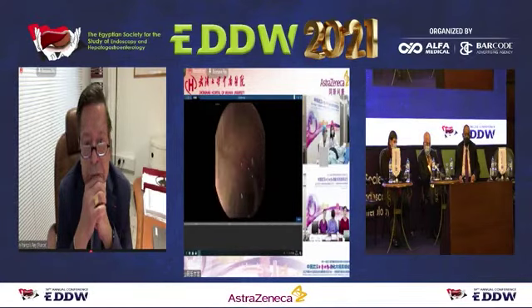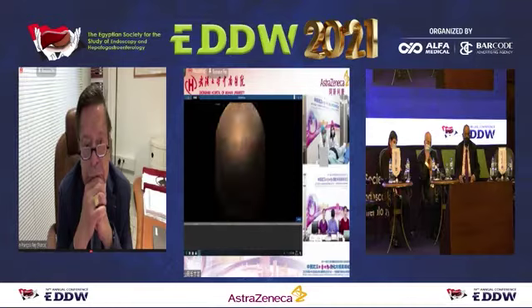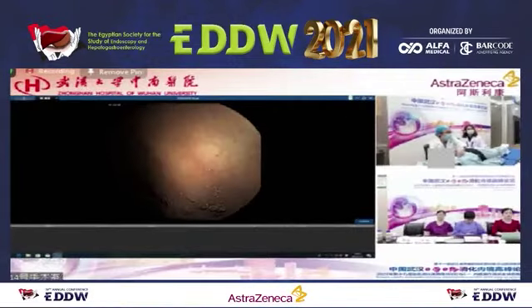Dr. Zhou, don't you see that the picture is dim? It's not a clear picture. Can you reach a conclusion from such a picture? Oh, okay, they want to get closer. We can get closer. Just give us some seconds. Let's look closer at the cardia.